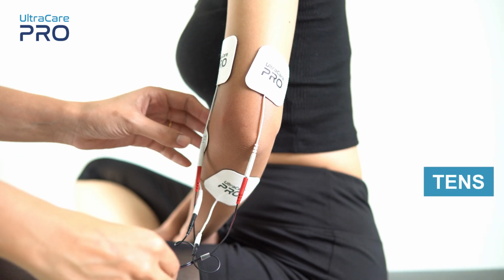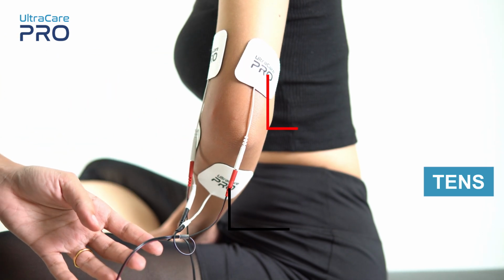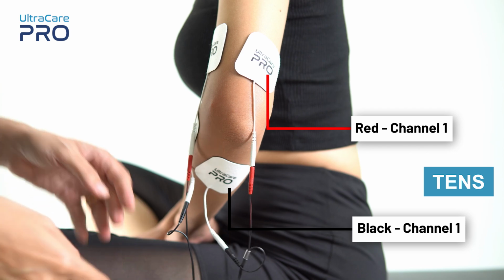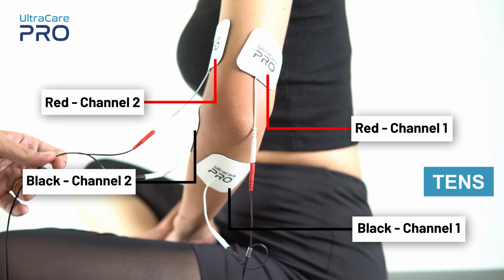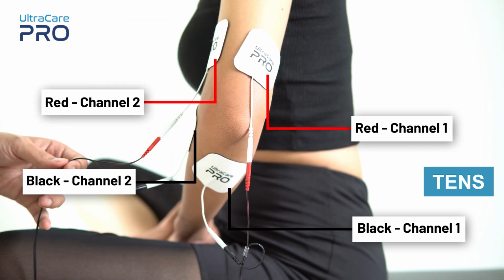For TENS application over elbow region, place red and black electrode from channel 1 on one side of the elbow joint. Similarly, place red and black electrode from channel 2 on other side of the elbow joint in a way that entire elbow region is covered.